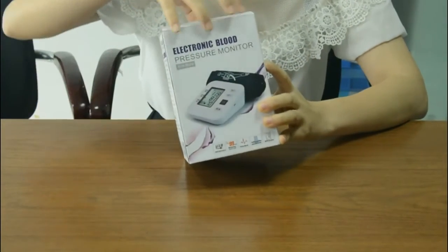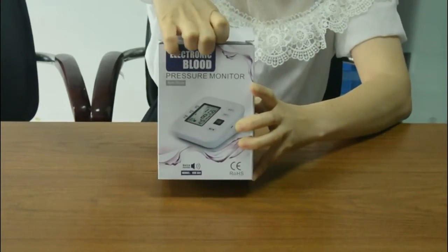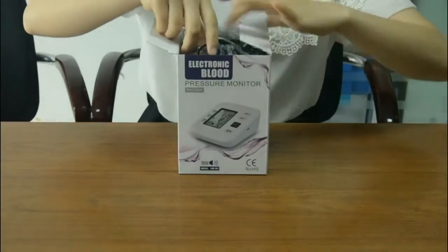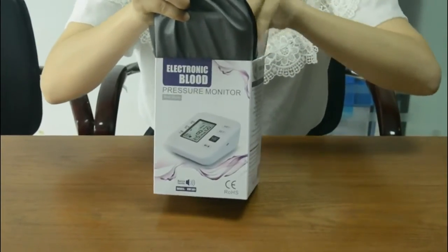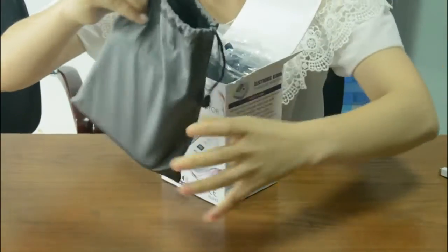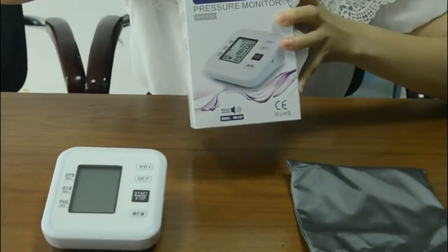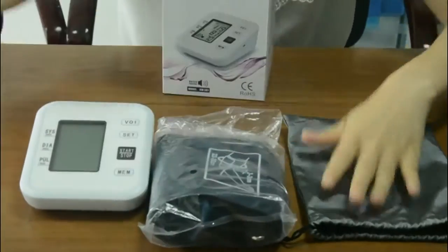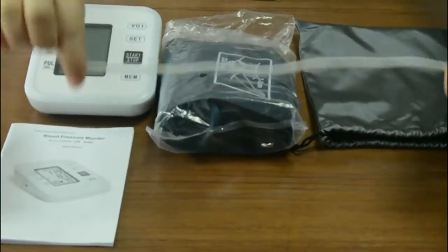Now I want to show you the items in the box. When I open it, you will see the device is packed in 3 bags. You can open it and you will see the main adapter device, the arm belt, one user manual, and a USB charger.